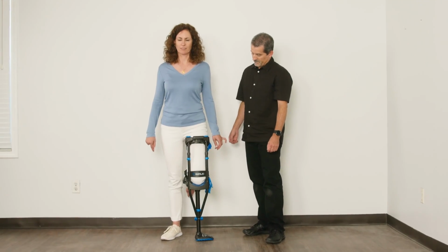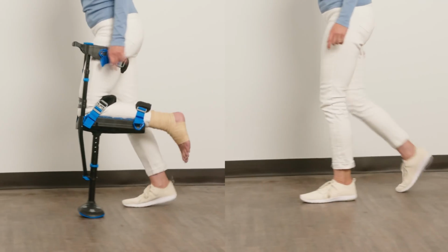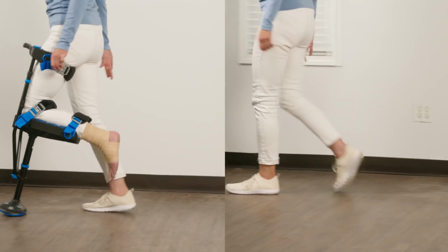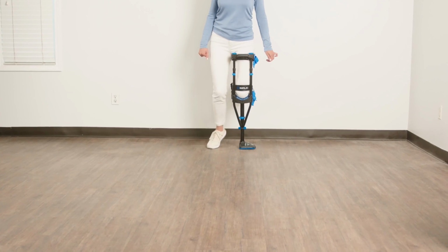Walking on the iWALK is very much like normal walking, but with minor gait adaptations. At some point, the patient's body will recognize this, and their gait will automatically adapt and become more fluid and efficient. As a fitter, your goal is to get the patient to this point. From here on, the patient will progress quickly.